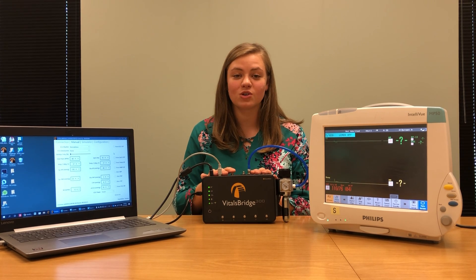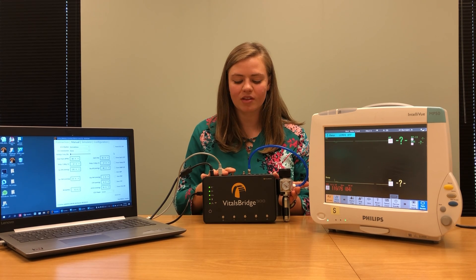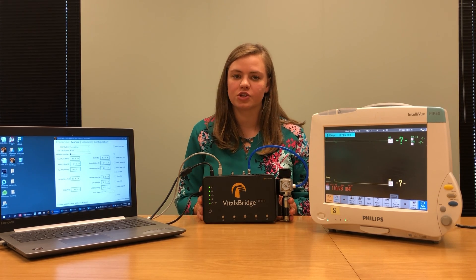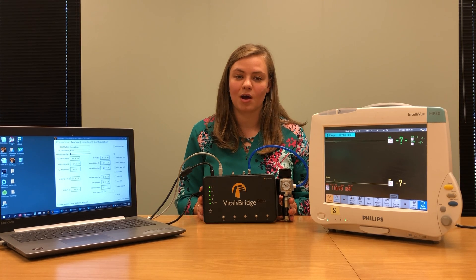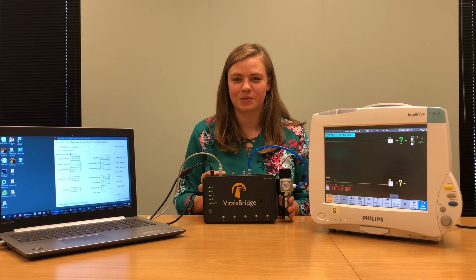Once you're ready to have CO2 flowing, simply take the pressure regulator and turn it on so that you have between 15 and 20 PSI of carbon dioxide being supplied to your VitalsBridge. You can also use a wall supply of carbon dioxide, but check with your facilities managers to make sure everything is at the proper pressures. The reason we use carbon dioxide is to simulate capnography. This VitalsBridge has been configured to work with sidestream or microstream capnography technology. For mainstream capnography questions, please contact support@vitalsbridge.com.